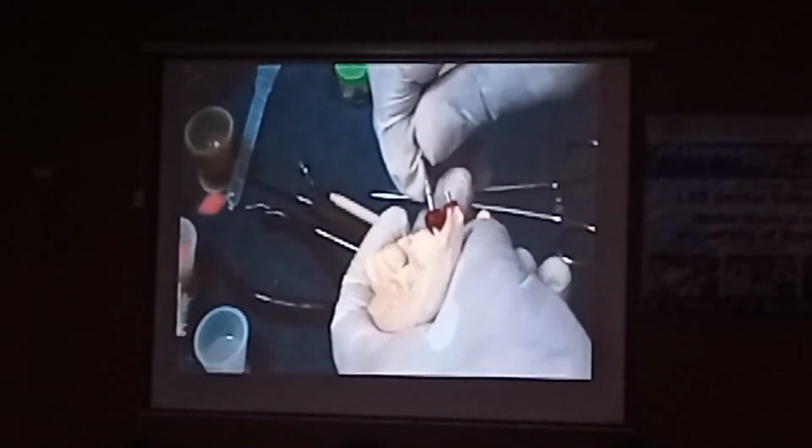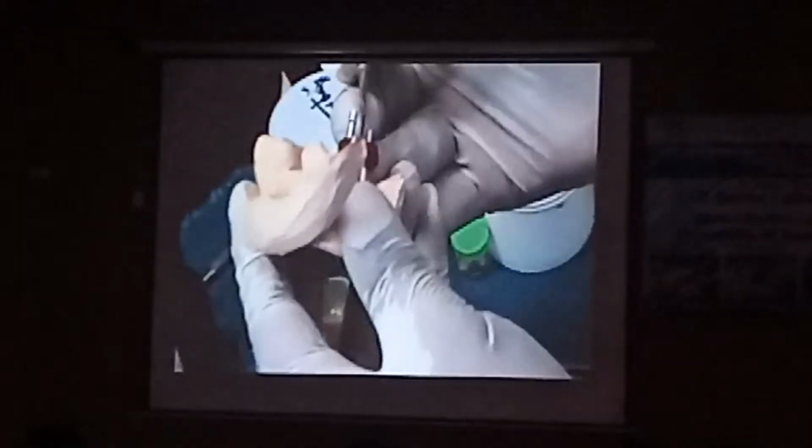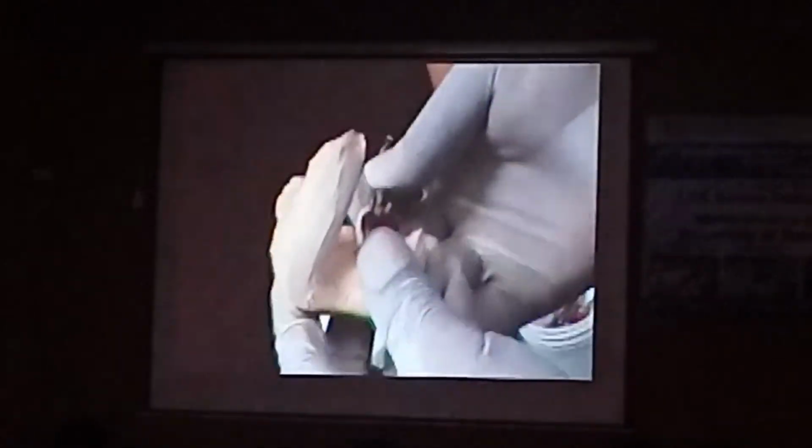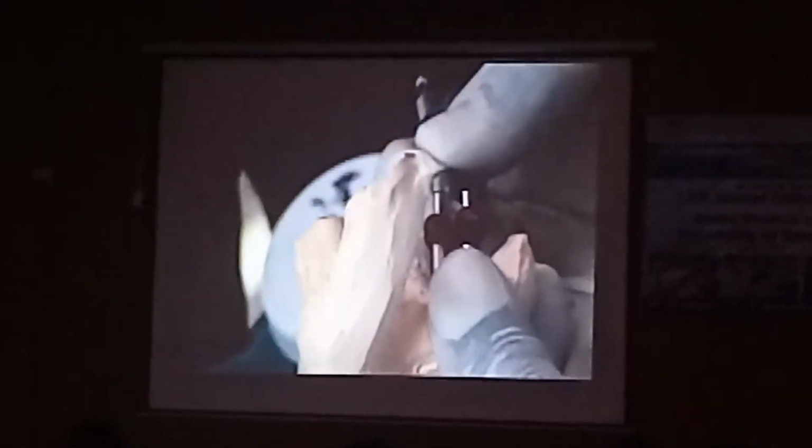Now we tried with the verification jig, the verification did not happen. So we are going to make a pickup impression. For a pickup impression, there is a gap here. Ideally there should be a complete gap. You should be cutting this also. There should be a complete through and through gap. My lateral should be going completely through it. So one of you can go and do it. Section it in this place only. Leave them all on the cast. Then section it.